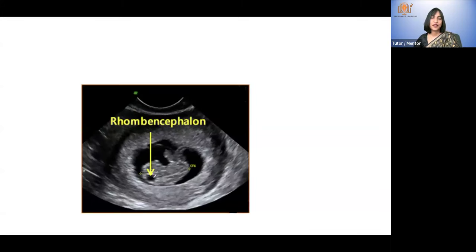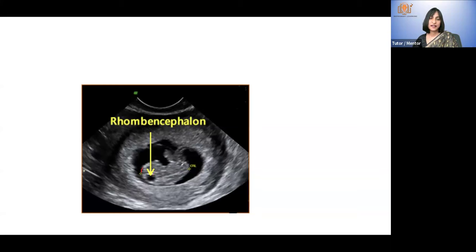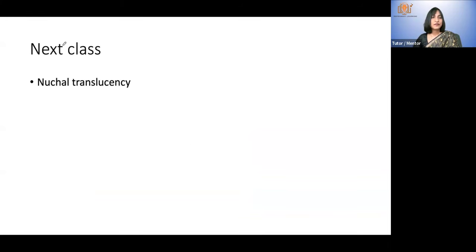Those are the limb buds. This is the rhombencephalon seen also in the earlier image. This is a sagittal view. That is the CRL — this is the head, this is the rump — and that is the developing umbilical cord. These are lower limb buds; upper limb buds must be somewhere nearby. You can see the choriodecidual reaction again, and it is thickening here, which is probably the site of the developing placenta. In the next class we will see nuchal translucency.